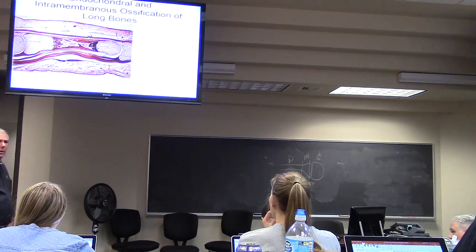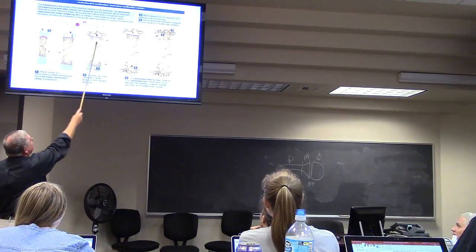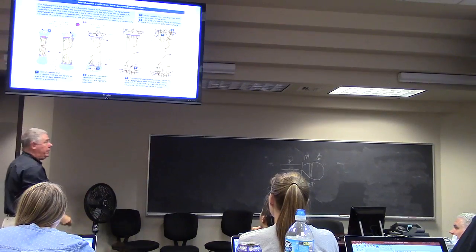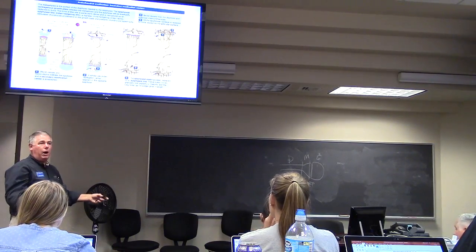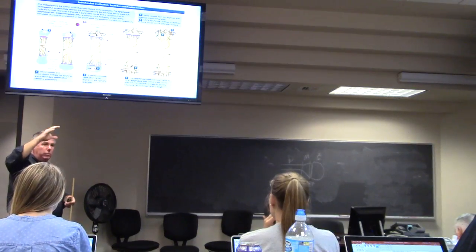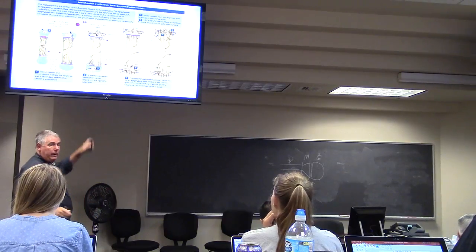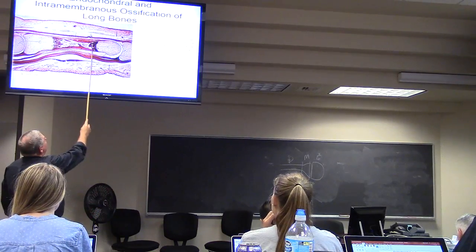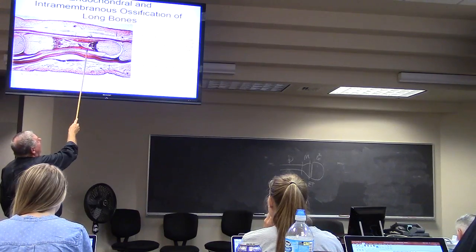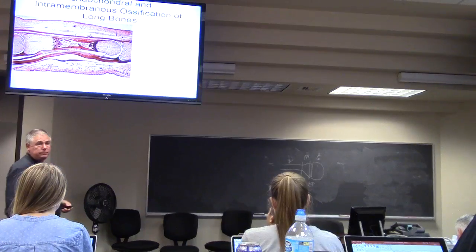Julie, you see what I mean? No? This is endochondral ossification. The growth plate is endochondral ossification. The resting, the reserve zone, the hypertrophic, and so on. That's endochondral, it's going that way. The spicules here and the Haversian systems out here in the compact bone, that's the intramembranous.